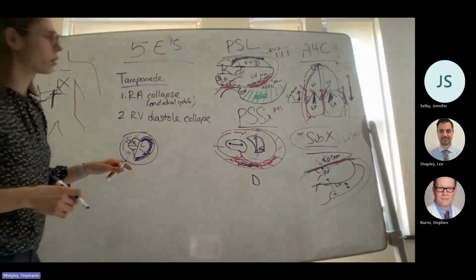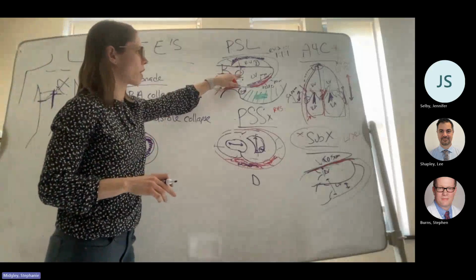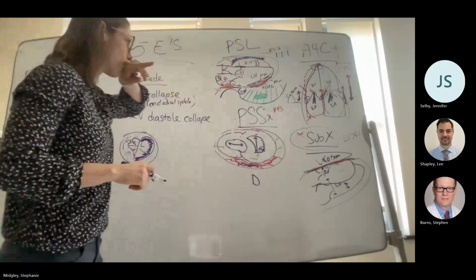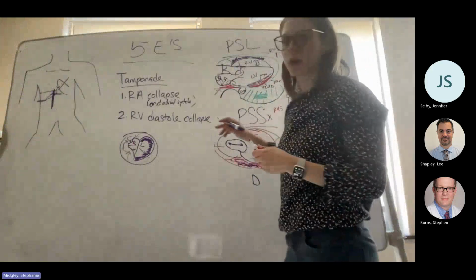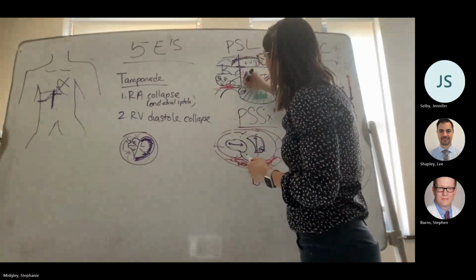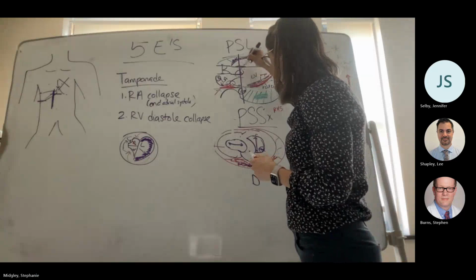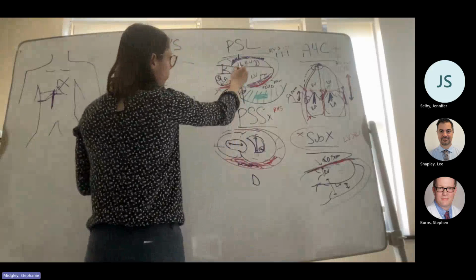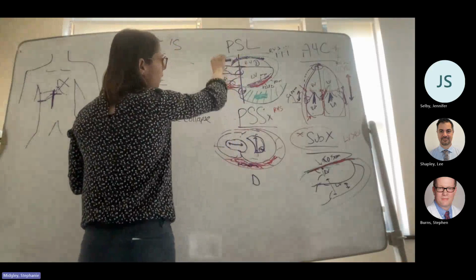It can be really hard to figure out when you're looking at diastole and systole, because your eyeball is trying to track the valve, and then you're trying to track what that right ventricle is doing. So a really easy way to do it is going back to our friends EPSS. So you put your M mode right here, through the tip of the mitral valve and then through the RV. And remember, M mode is only going to detect motion that touches this line in the up-down function.